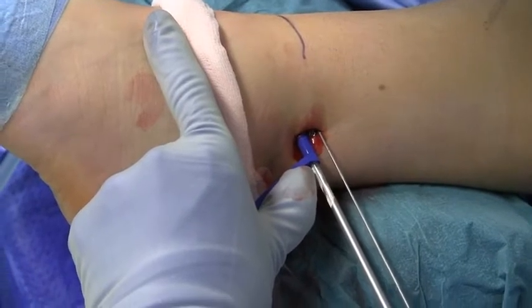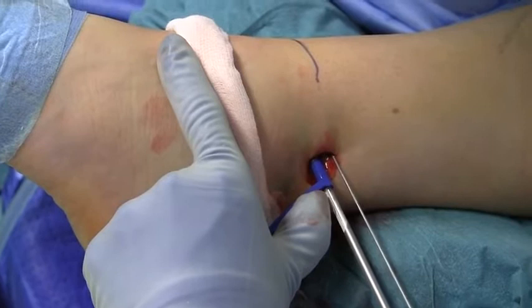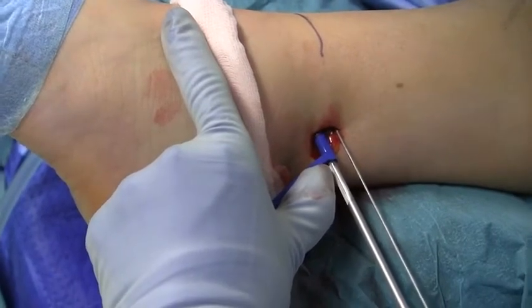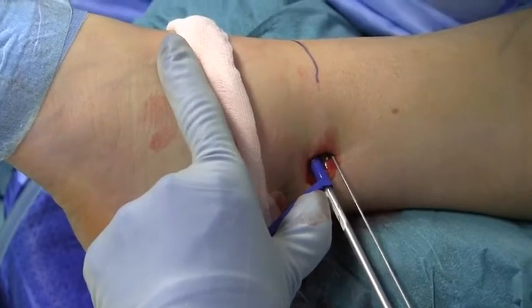There is a slight difference in diameter between different suture button brands. The drill bit in the Ziptide kit is 3.2 mm compared with the 3.7 mm drill bit in the Tightrope kit.